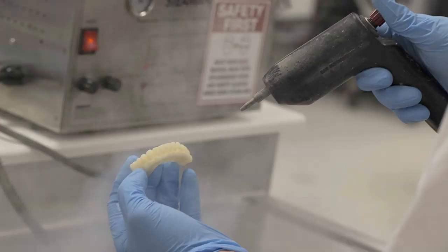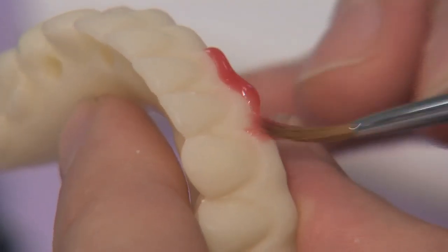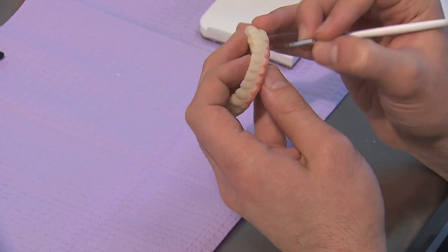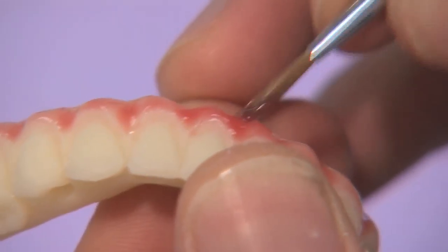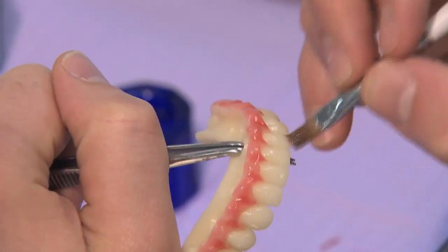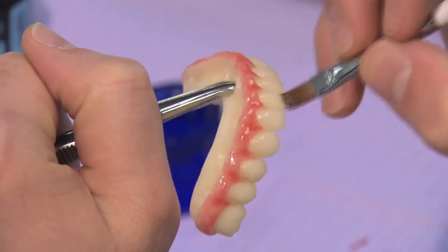It is then steam cleaned to ensure a particulate-free and sanitary surface prior to staining. Lastly, stain is applied to the gingival areas and glaze is applied to the entire surface of the provisional prosthesis to give a more natural-looking appearance during patient confirmation of the definitive design.